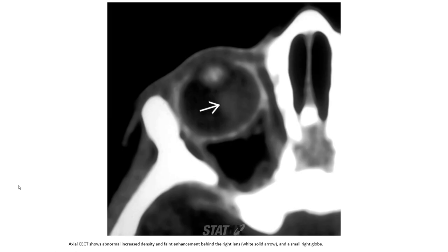This is a case of PHPV on CT imaging. Abnormal increased density and enhancement between the right lens and the small right globe is seen, which is characteristic of PHPV.